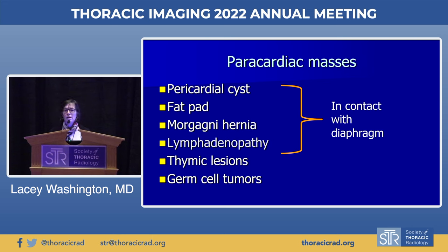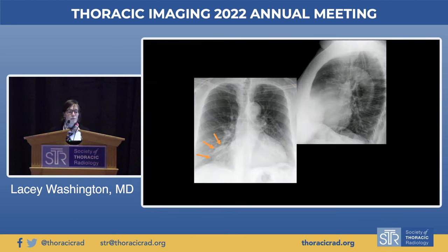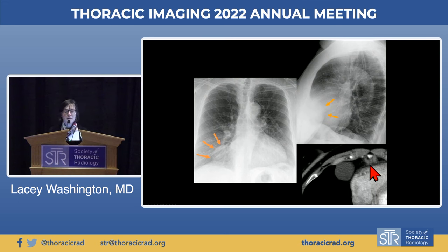Masses in contact with the diaphragm include pericardial cysts, large fat pads, Morgagni hernias, and lymphadenopathy. Thymic lesions and germ cell tumors generally aren't in contact with the diaphragm, though there will be exceptions. Confirmed on the lateral as a very anteriorly located mass, on CT this is a completely water-attenuation mass with an imperceptible wall — classic pericardial cyst.